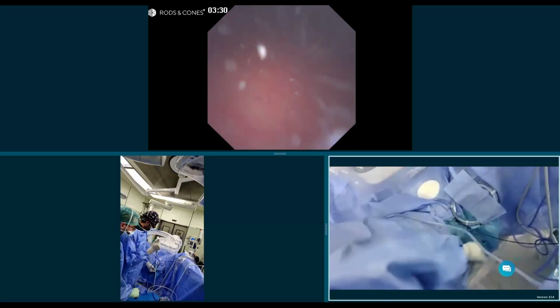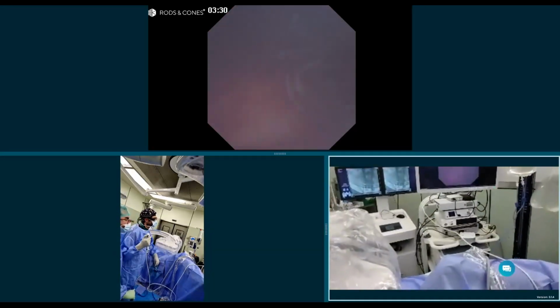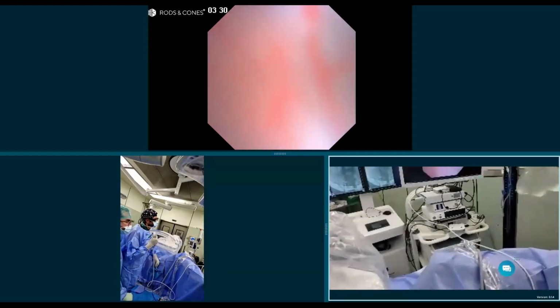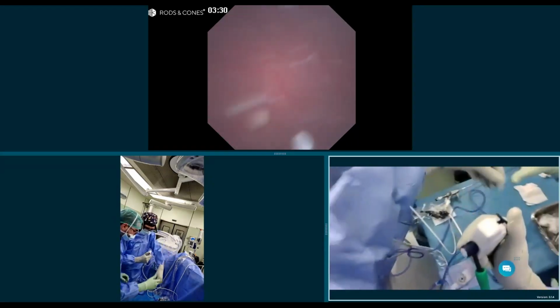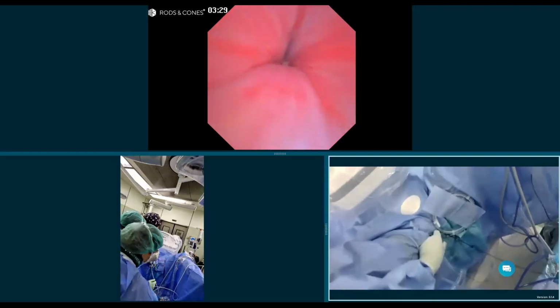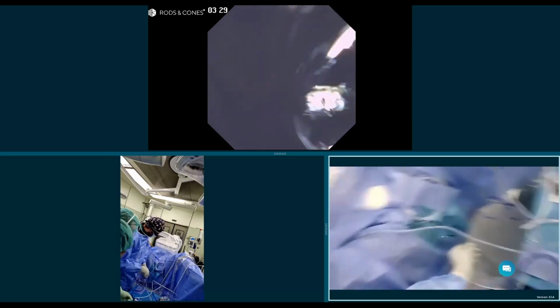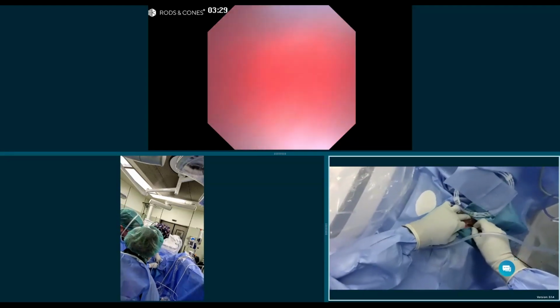Yeah. I'm going to remove my guide wire. There's no trouble. We have no problems with the ureter. Look for it. Dame la guía. So we put this on the table. Excellent. We see it's organized. We're going to use the guide wire to get in. Excellent. ¿Tienes? Vale. Voy a entrar otra vez. I'm going to get in with the guide wire that we had, just to avoid. Excellent.